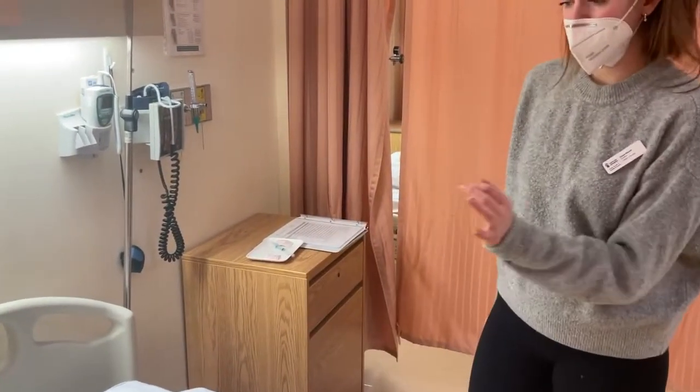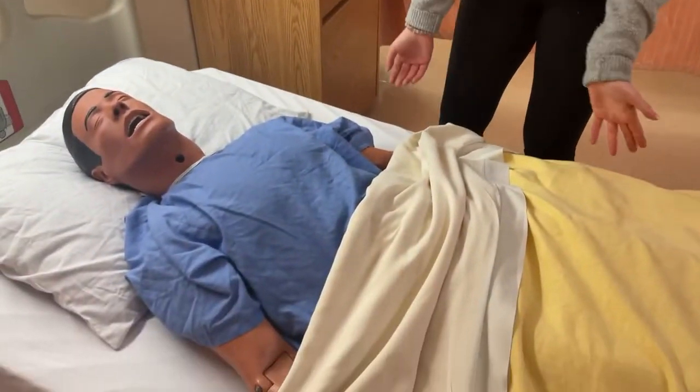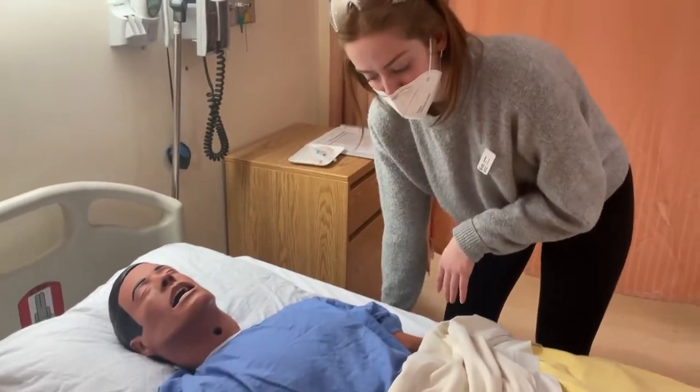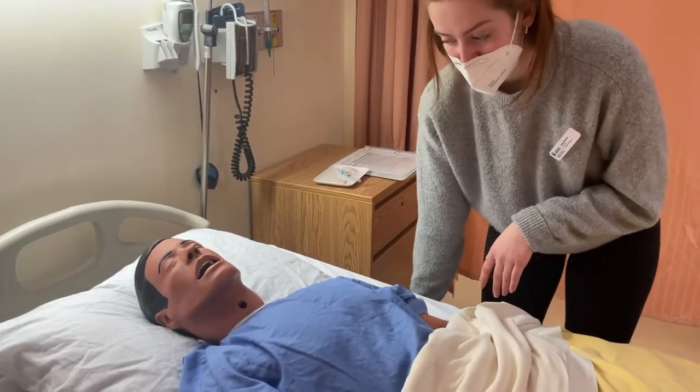Performing a general safety check, the room is clean. He's in a lowered position in his bed, which is proper for safety. I'm just going to lift you up, okay? We are making sure that we're not contaminating. At this point, we want to wipe down the top of the vial.